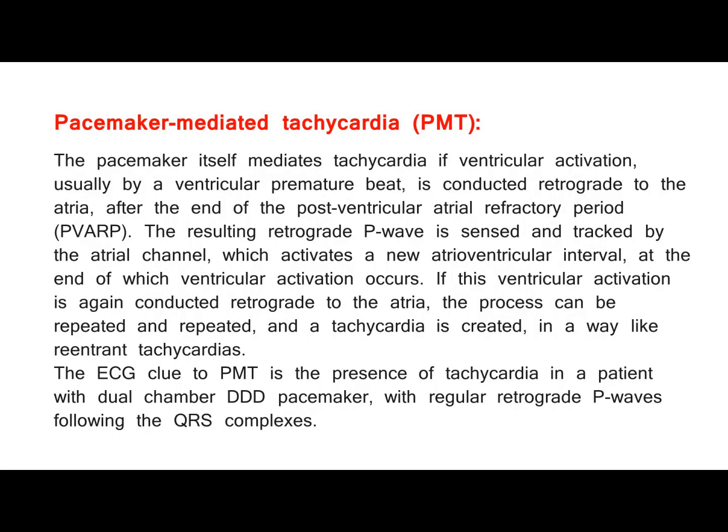Pacemaker-mediated tachycardia, PMT. The pacemaker itself mediates tachycardia if ventricular activation, usually by a ventricular premature beat, is conducted retrograde to the atria after the end of the post-ventricular atrial refractory period, PVARP. The resulting retrograde P wave is sensed and tracked by the atrial channel, which activates a new atrioventricular interval, at the end of which ventricular activation occurs.